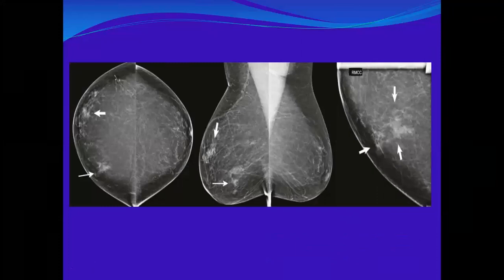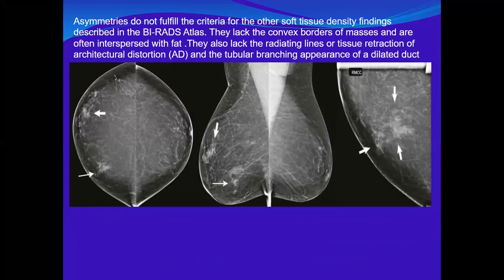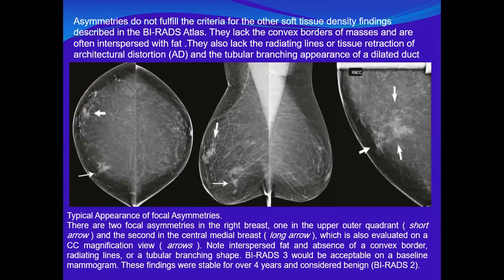Okay. And if you look here, what is this? There are arrows representing what? Areas of focal asymmetries. Excellent. Well done. Who's talking? I'm Sarah. Hello, Sarah. Yes, these are what I brought this image for. Okay. Why this case? To know that the focal asymmetry can be multiple. See, not necessarily to be one. These are multiple areas of focal asymmetries.